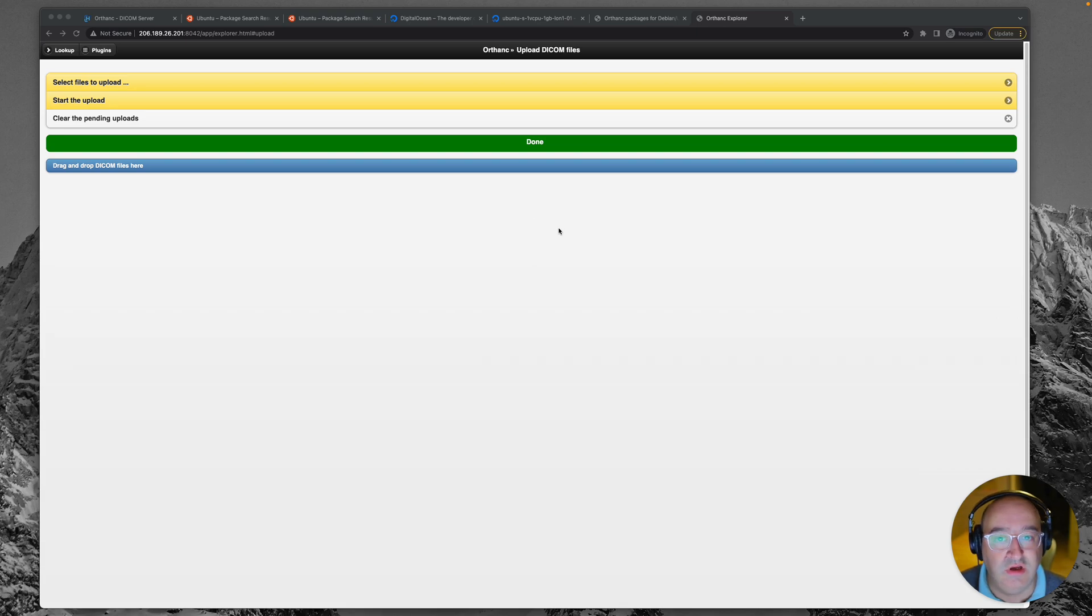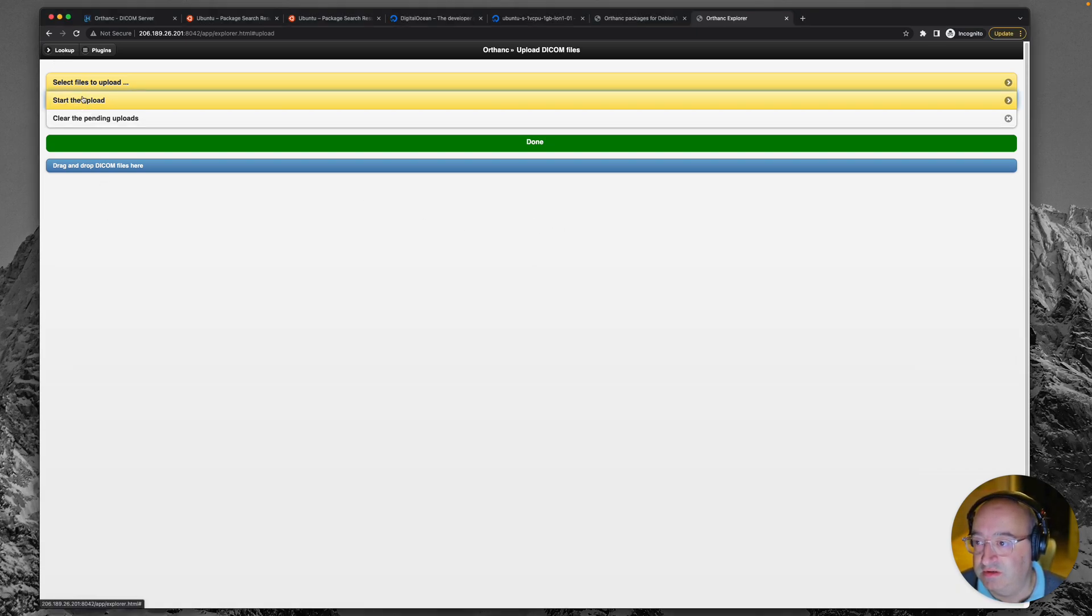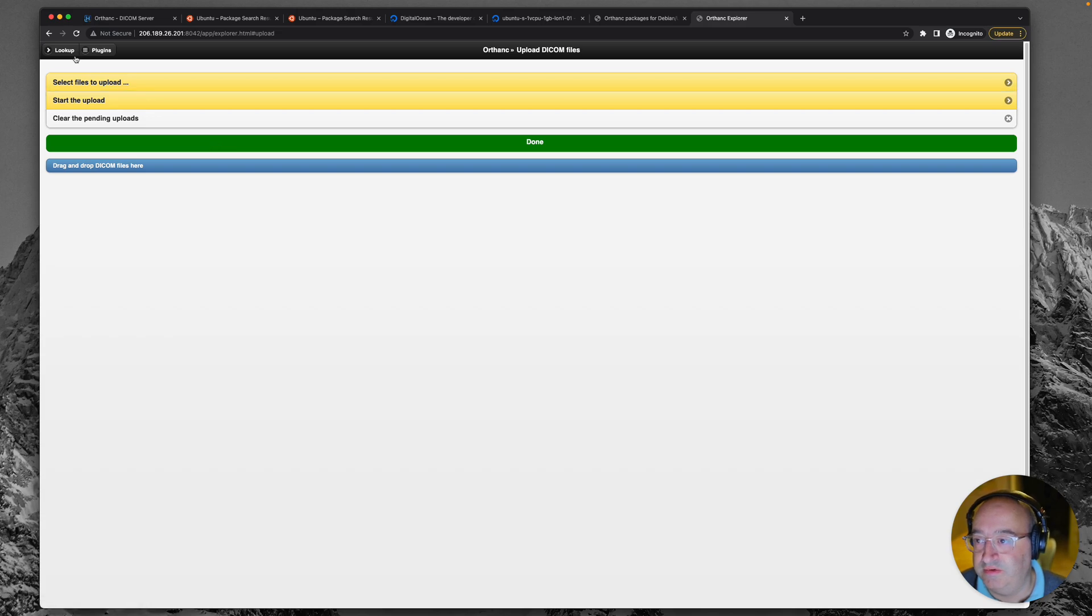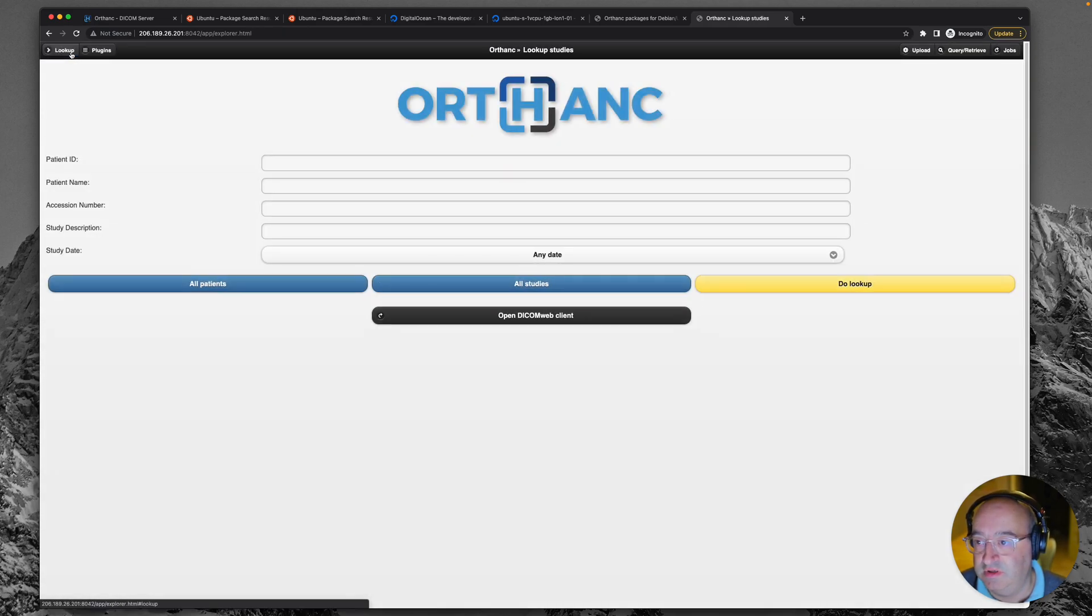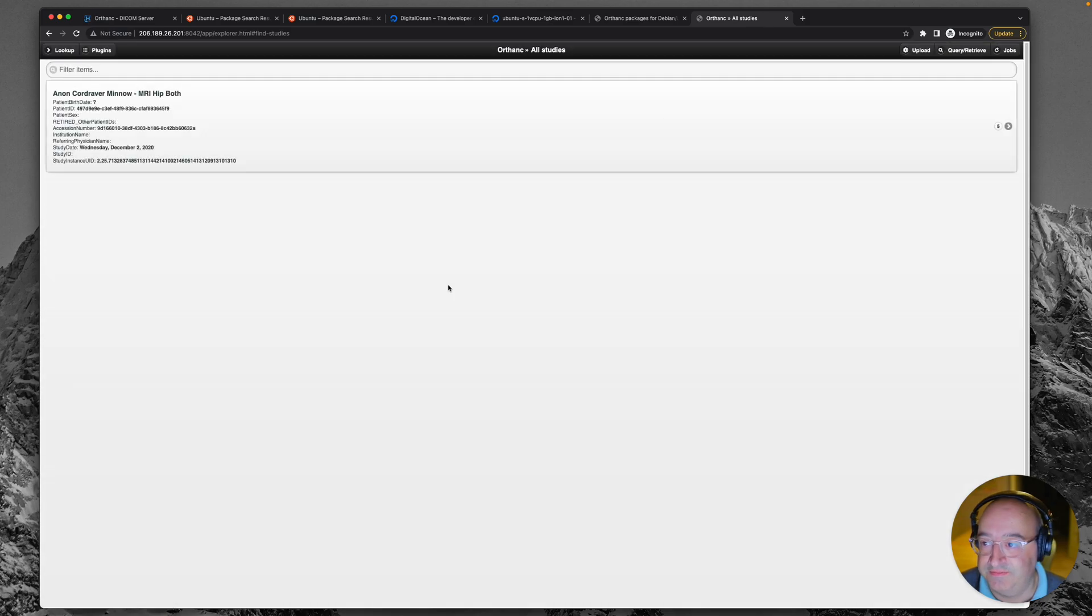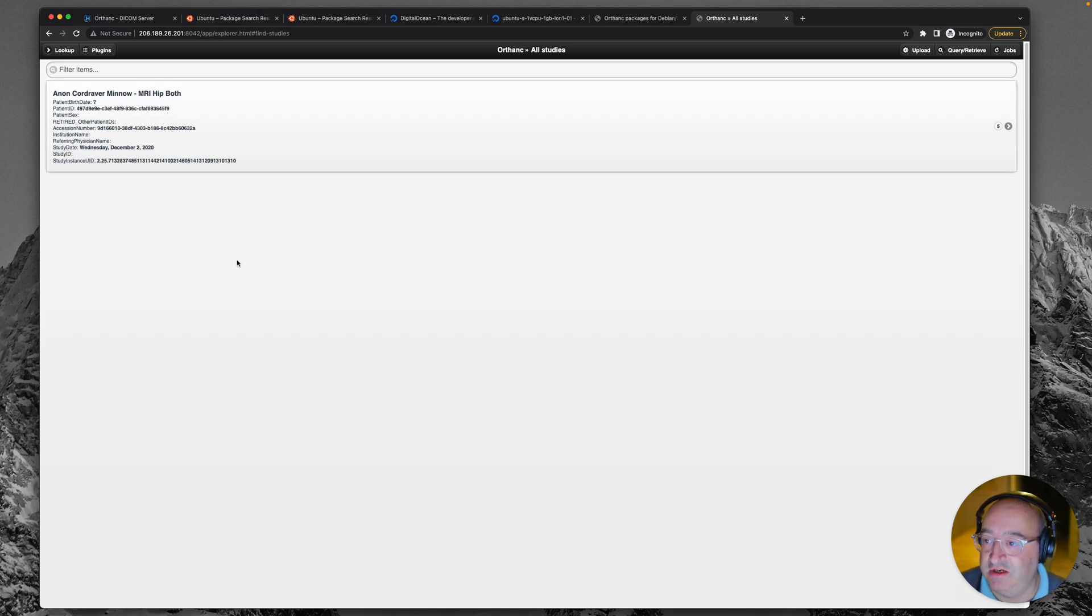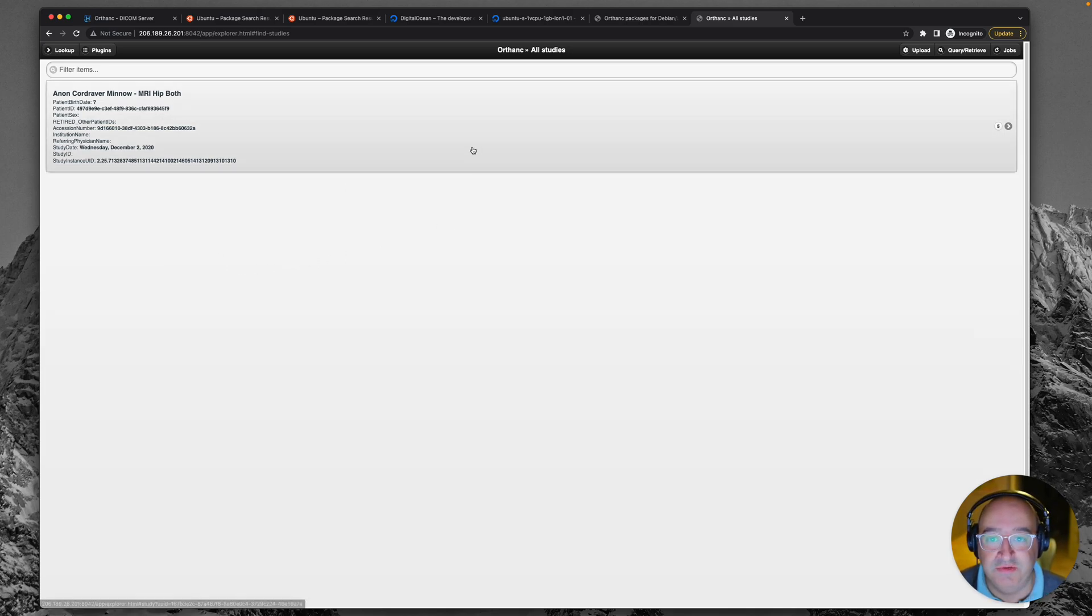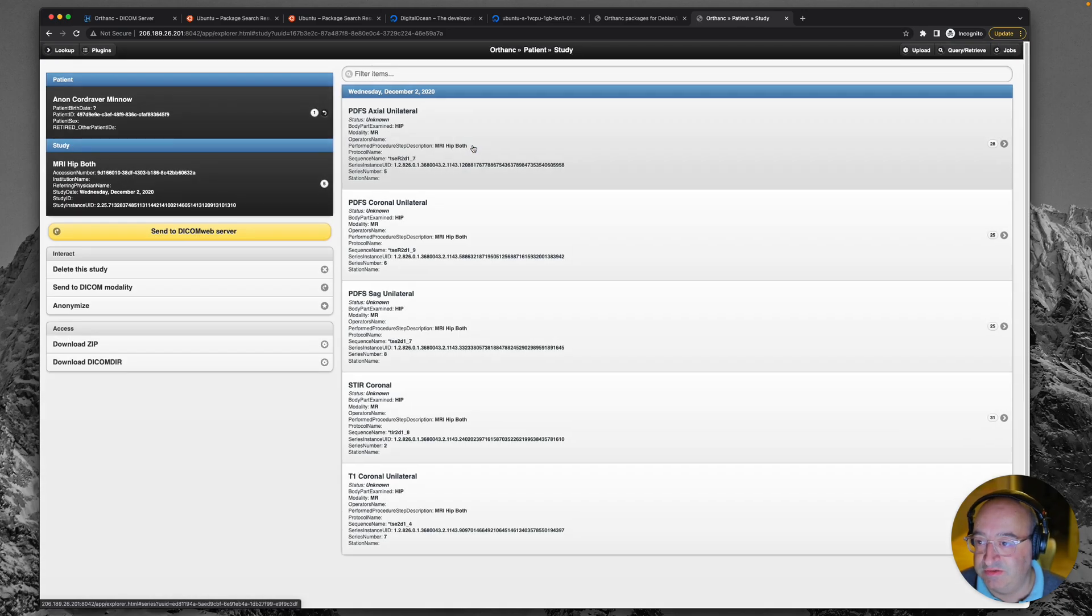Okay. So let's go back to look up and hopefully in all studies, we've now got some images. There we go. That's a kind of a weird name, but I guess that's some anonymization name. MRI Hip Both. Let's have a look.